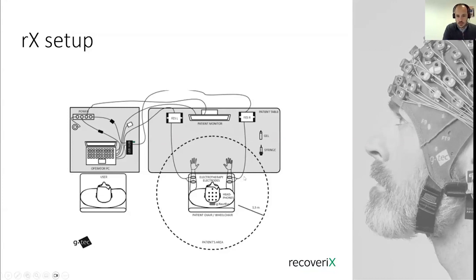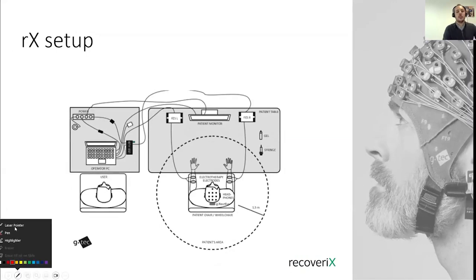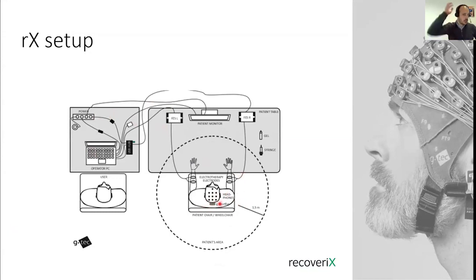I'm not sure if you can see. Here, the laser pointer. Sorry. So this is the EEG cap. We have the Nautilus attached on the occipital side. This Nautilus is connected wirelessly to the base station. The base station is connected by USB to the computer.